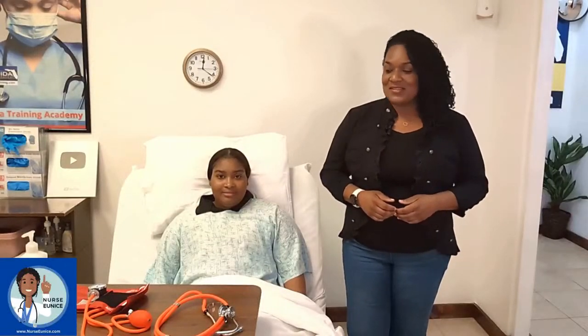Hello everybody and welcome. My name is Nurse Eunice and in today's video I'm going to be showing you how to perform a manual blood pressure. I have my wonderful assistant, Anija, and she's going to be in a couple of our videos.